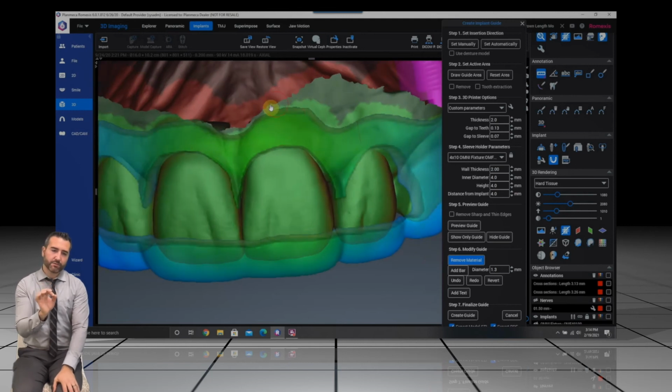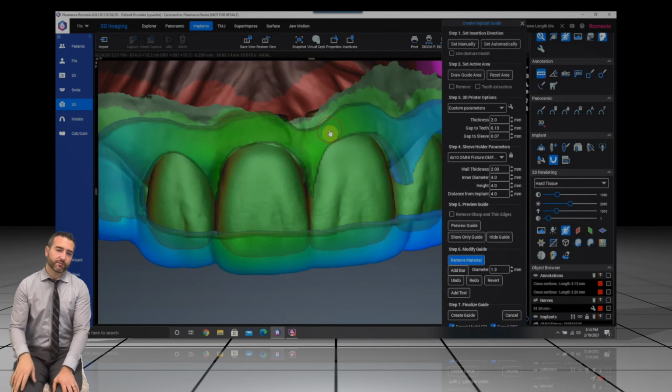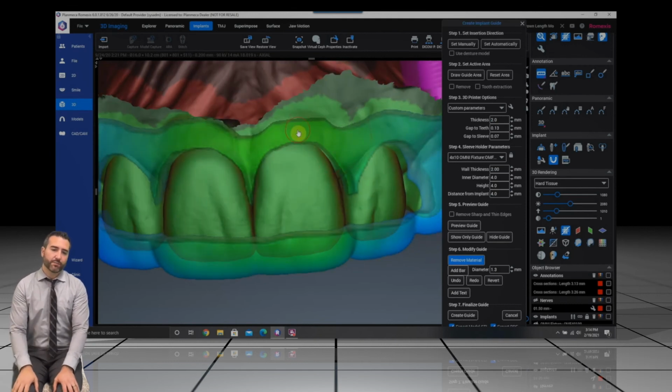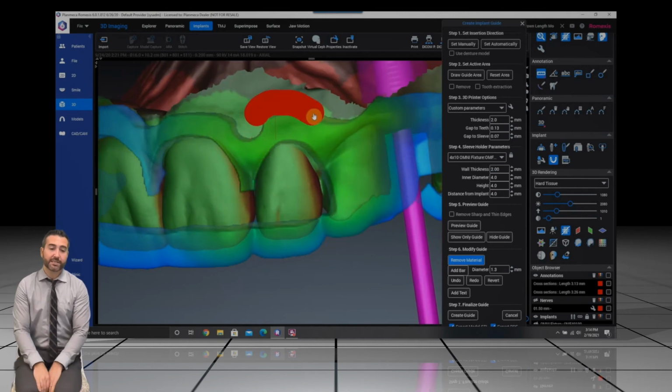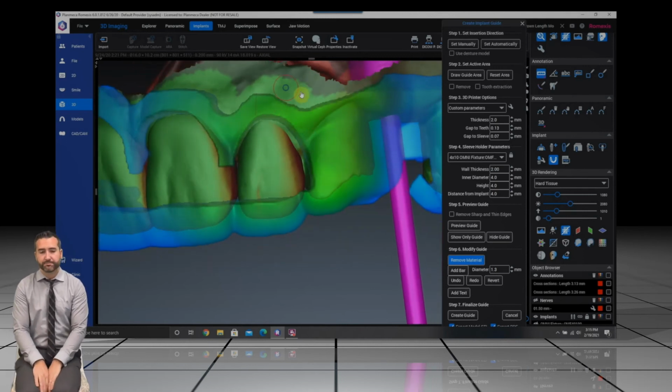And so that's going to do our ossectomy, our bone reduction to that level to ensure that we have that perfect biologic width there. And so we're going to use not only this as a soft tissue guide, but as a hard tissue guide during surgery.